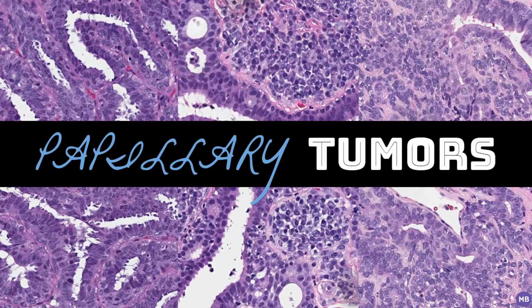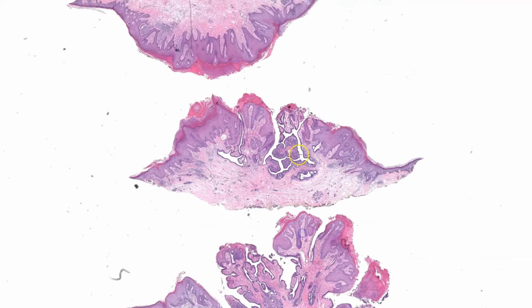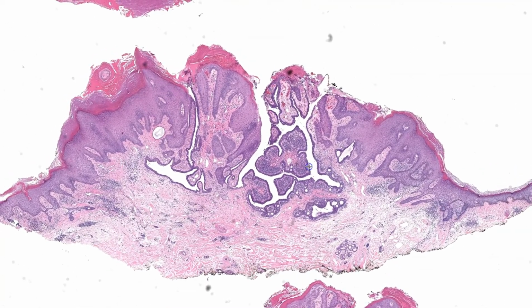Now, before I start getting too sentimental, let's get into our final unknown case, which, as usual, you can view yourself using the link in the video description. This is an exophytic lesion on the scalp of a 23-year-old female. With low power, you can see that this lesion is definitely exophytic and papillary. However, there is also an endophytic component that also has a papillary architecture, as evidenced by these floating islands of epithelium with a fibrovascular core.